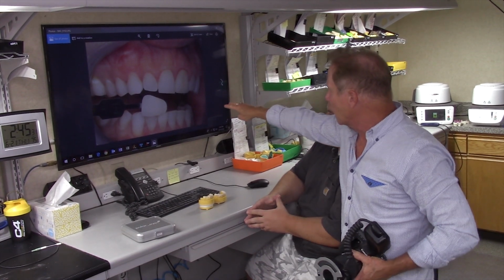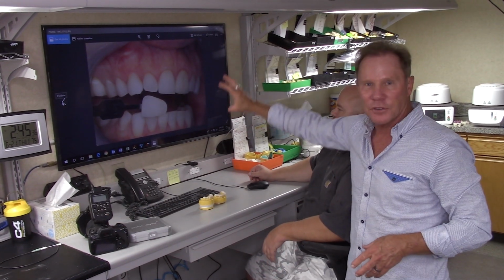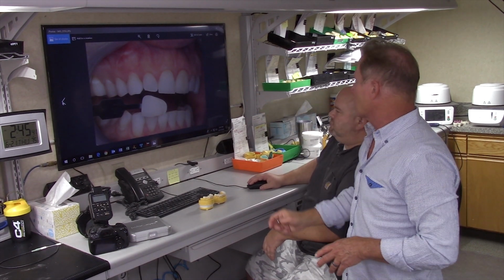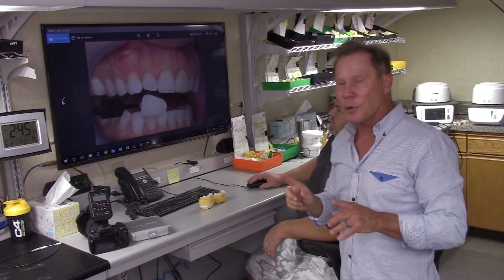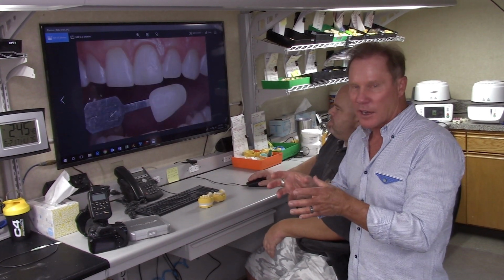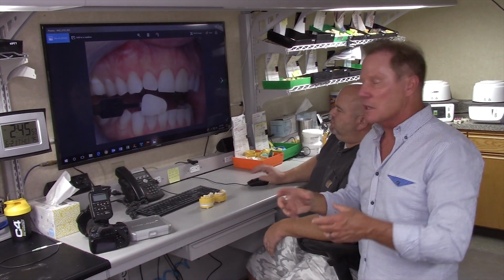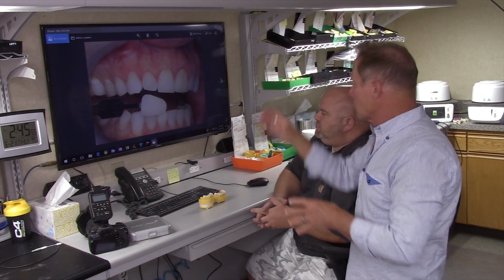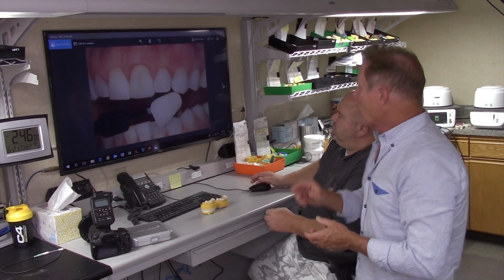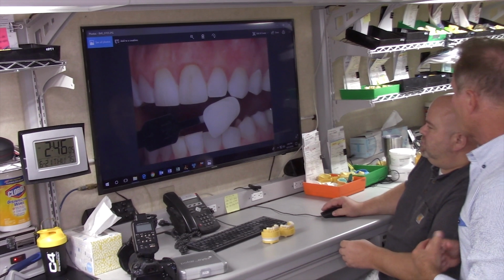So as you look at this photo, notice that we've muted all the reflective areas out. So he can see the depth, he can see surface characteristics, he can see especially hypocalcification, because it really almost exaggerates the hypocalcified areas that you don't see in other photographs. So what I did here is all the different shade tabs that are close to areas within the teeth we're trying to match, I took them with the regular ring flash and then with a polarized filter.